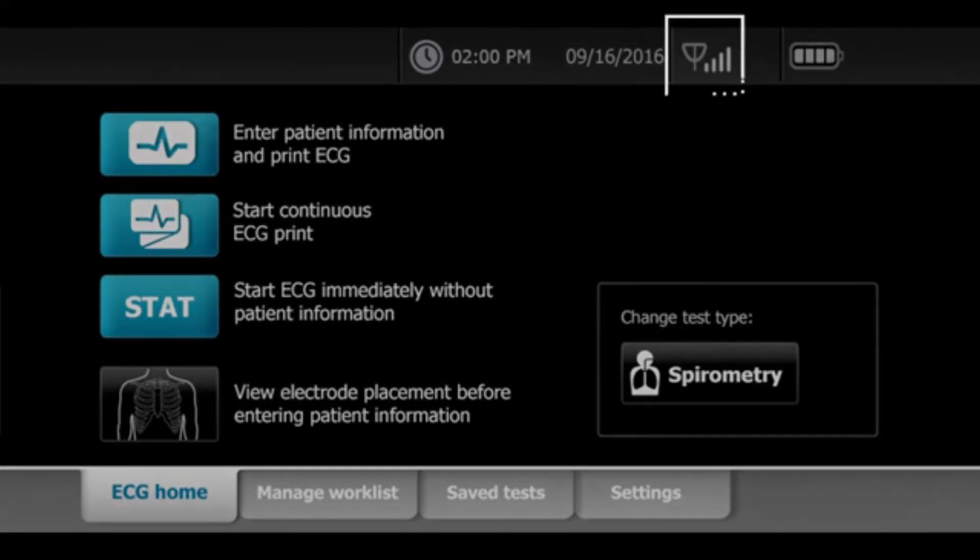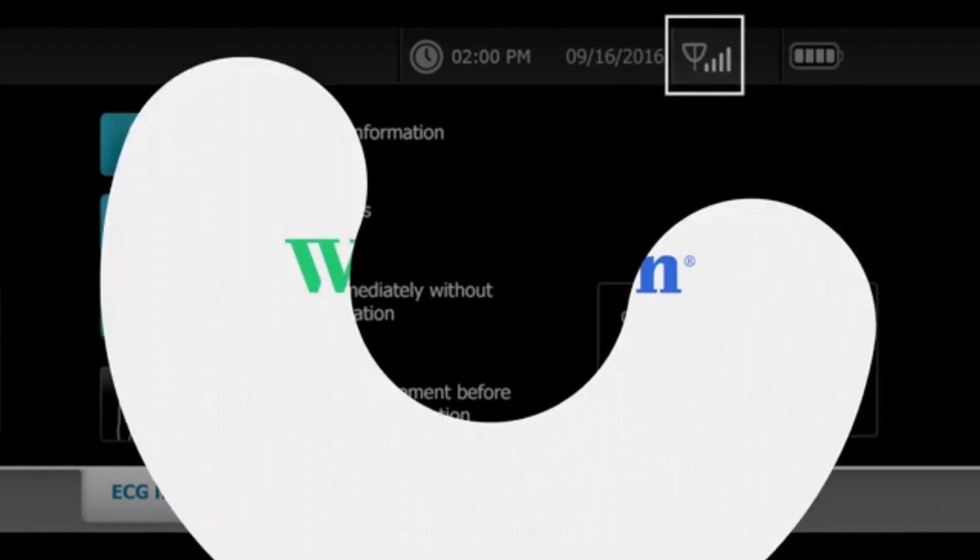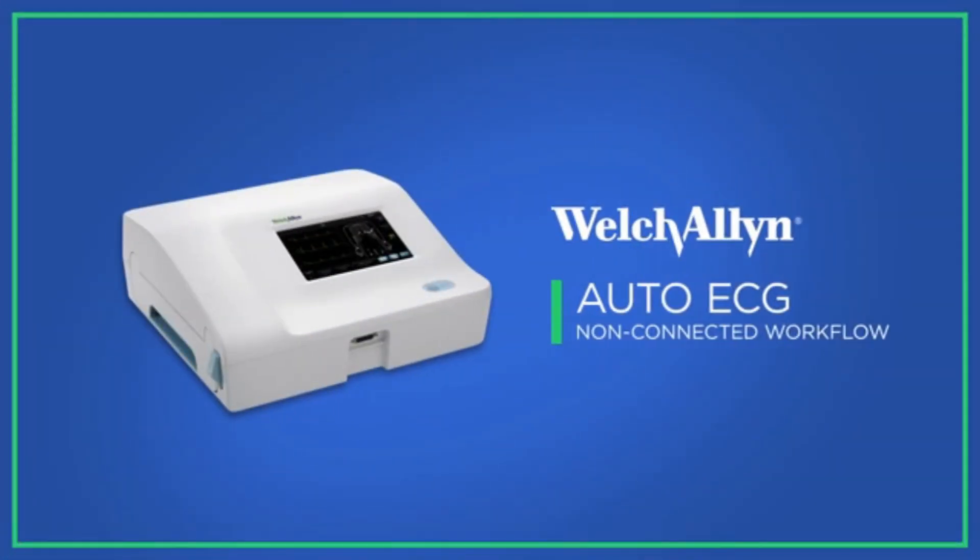If you're using optional spirometry, the spirometry button appears on the screen. If you're using optional wireless capability, you will see a radio icon with signal strength in the status bar. We will now go through several workflow examples, both in a connected and a non-connected environment.